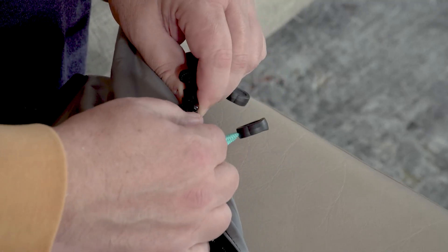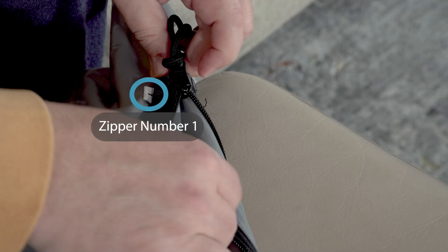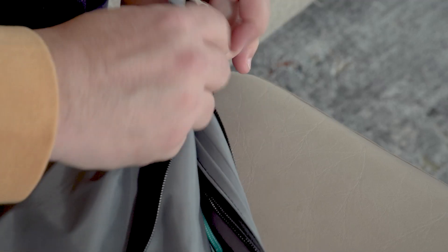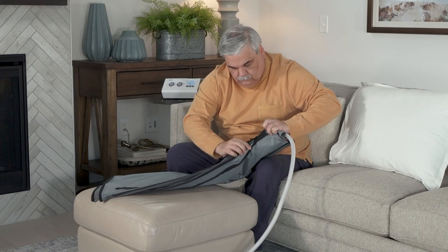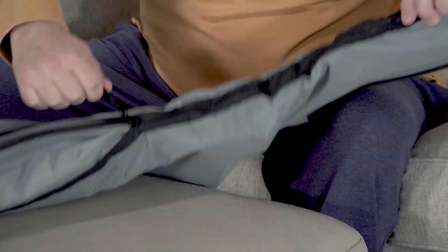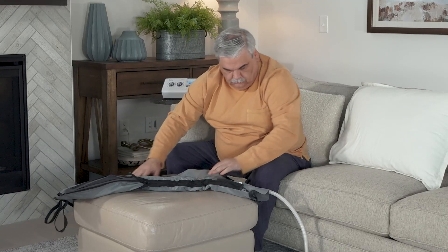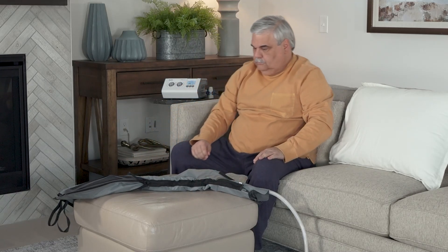If you are using an arm garment, zip the garment completely closed. If you are using a leg garment, zip the garment approximately half closed to create a boot you can pull on and off with ease. Please note, if the suggested configuration is too tight or too loose, try another zipper configuration until the garment fits comfortably.